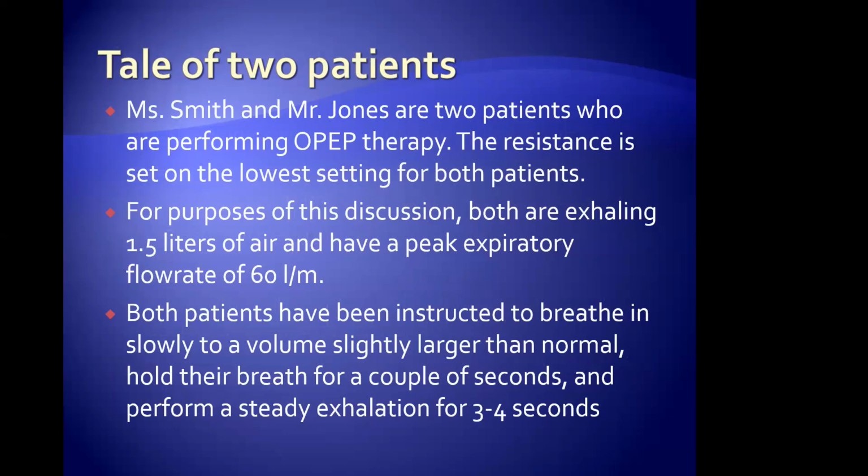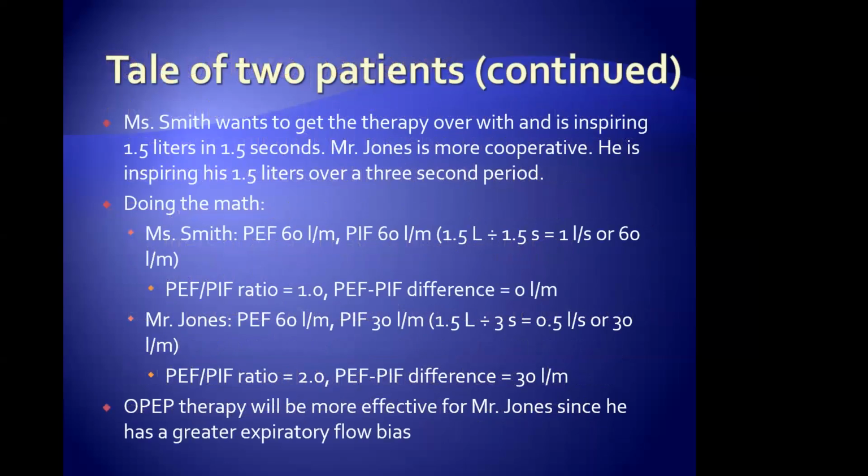Okay, pretty generic. Both patients have been instructed by you and me, breathe in slowly to a volume slightly larger than normal, hold their breath for a couple of seconds, and then perform a steady exhalation for 3 to 4 seconds. So we're coaching them up. We're doing that instruction. We're teaching them. So Miss Smith wants to get the therapy over with. She's got a hair appointment later and she's ready to go. Mr. Jones is more cooperative. He's inspiring at 1.5 liters over 3 seconds. He's got yard work to do today, so he's taking his time doing this.